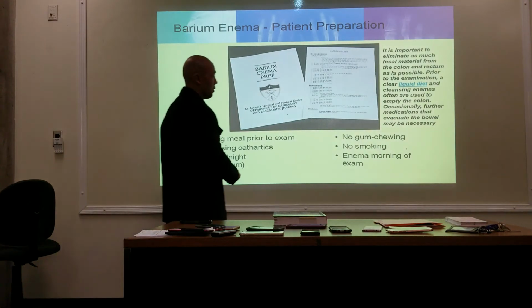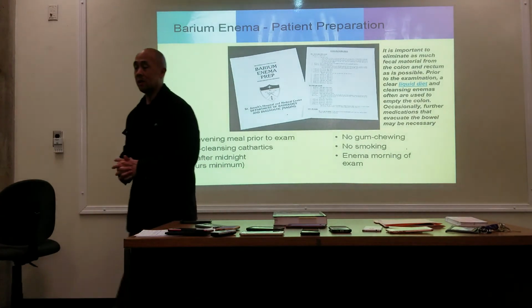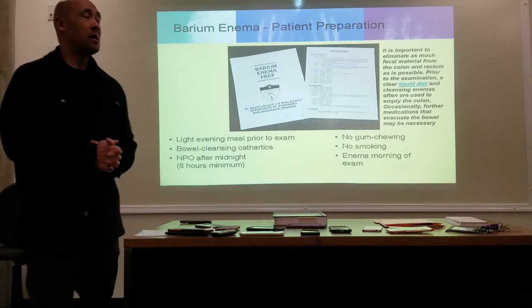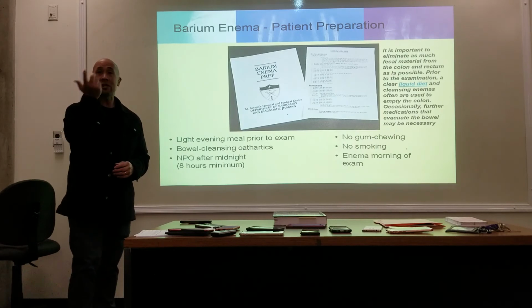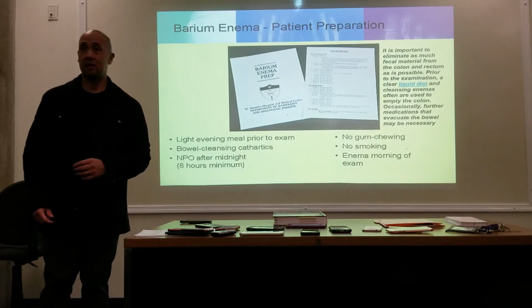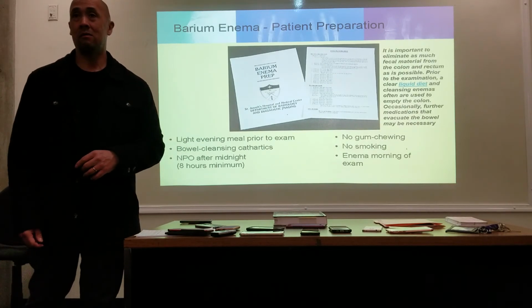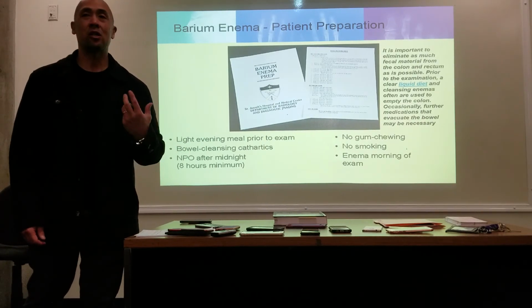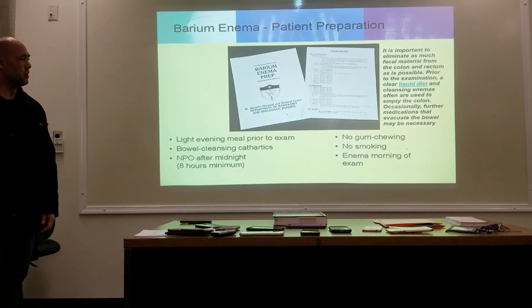Again, it's good to know whether they've chewed any gum or smoked. But you'll never hear your technologist ask their patient that. It's one of those things that they omit. So if you hear them omit that, don't be surprised. And then they also may have another enema, some type of cleansing enema prior to the procedure.